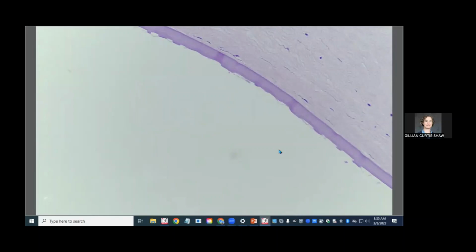and it wasn't uncommon for them to have as a specimen on the slide a tiny strip of just Descemet's membrane. The clinicians would take a flimsy piece of Descemet's membrane, for diagnostic purposes or sometimes to treat them, and they'd discuss the shapes of the guttae for about 10-15 minutes on a 0.5 micrometer section of something, and I'd be like, oh, geez. Ocular pathology in the veterinary world is much more interesting.